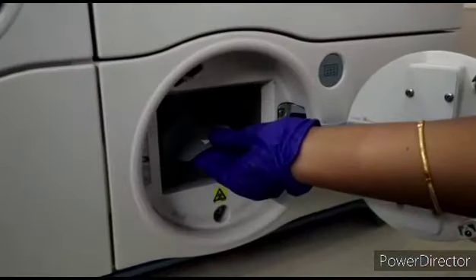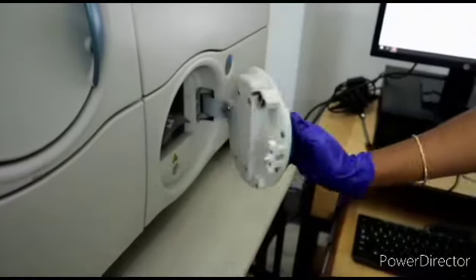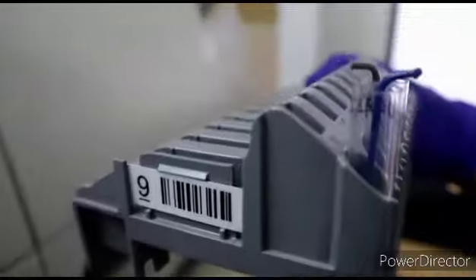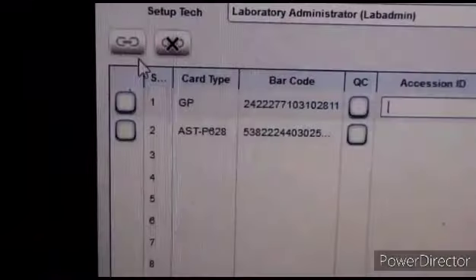Here in this section, the tubes in the cards were cut by laser beams in the machine, and then the cards were moved into the incubator. Every 15 minutes, the changes in the cards were detected by the machine. After 12 to 18 hours, the final results of bacterial species and minimum inhibitory concentration were identified.